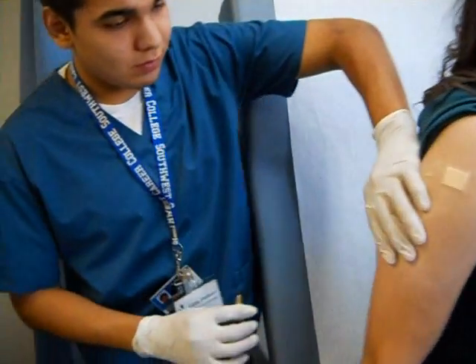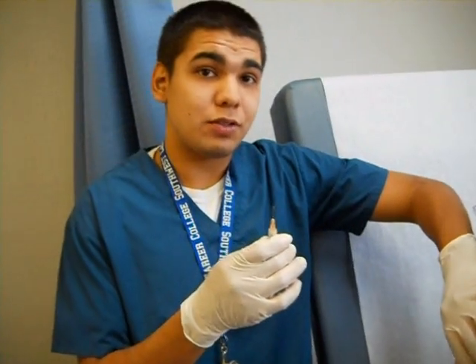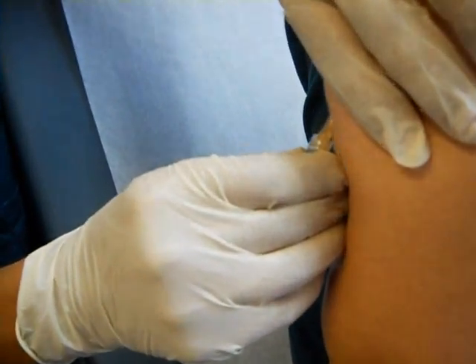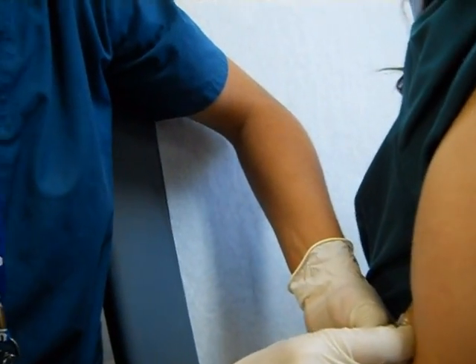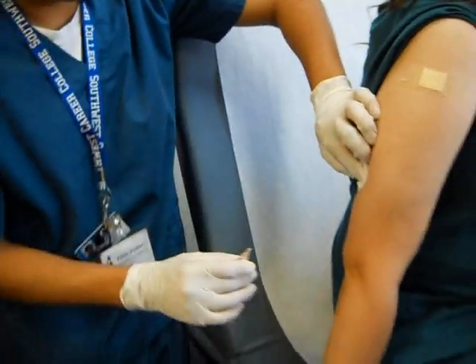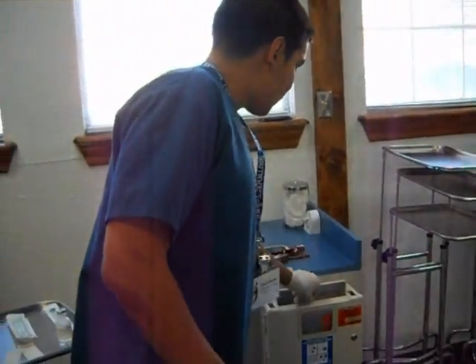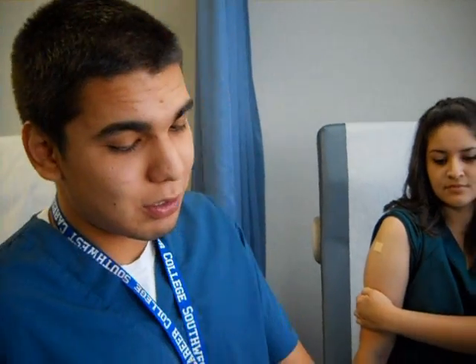Always be careful locking your needle so you don't suffer a needle-stick injury. Make sure you have the correct spot. You always want the bevel of your needle to face out towards you. Make sure to aspirate, and then you're done. Always remember to have sterile gauze with you. Afterwards, same procedure — apply a band-aid.